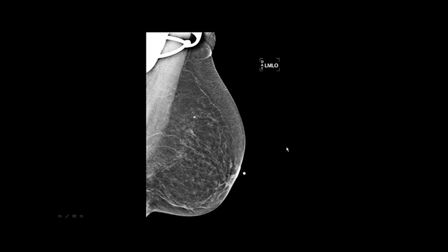So it's really easy for the patient to get other body parts in the image, but you have to watch them 100% of the time. It's like sometimes babysitting. You just cannot keep your eye off them because they're going to move on you.